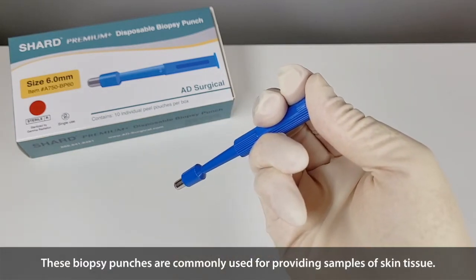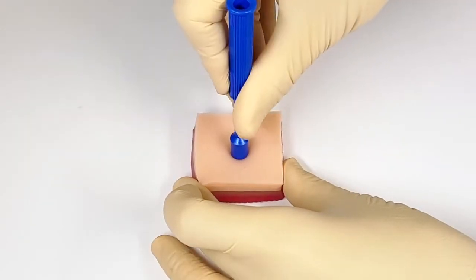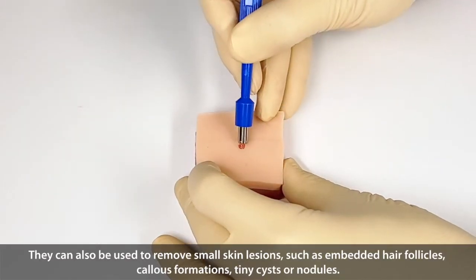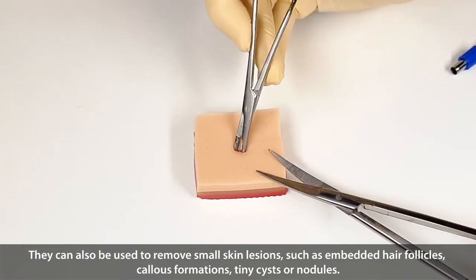These biopsy punches are commonly used for providing samples of skin tissue. They can also be used to remove small skin lesions, such as embedded hair follicles, callus formations, tiny cysts, or nodules.